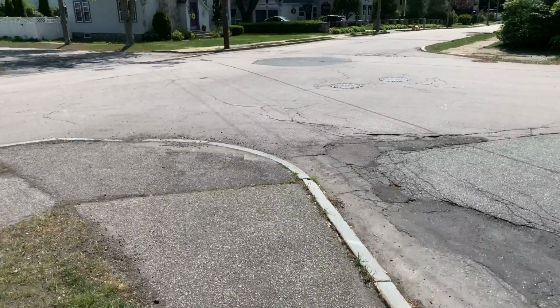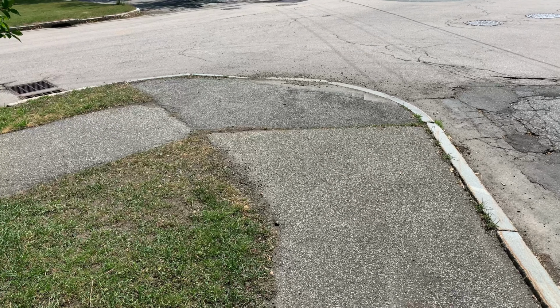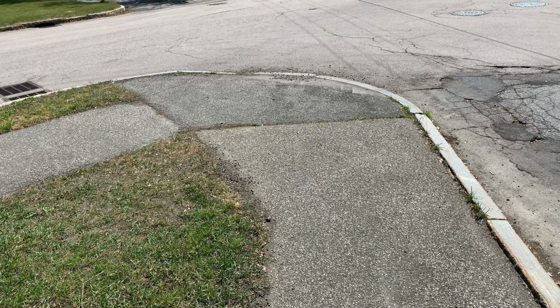Another way is to use the down slope of the corner. So corners that are blended into the street tend to slope down, and you're able to feel that through your feet. So the proprioception through the feet, you can feel the tilt of the ground towards the street. So that can be an indicator that you're coming up to a corner.